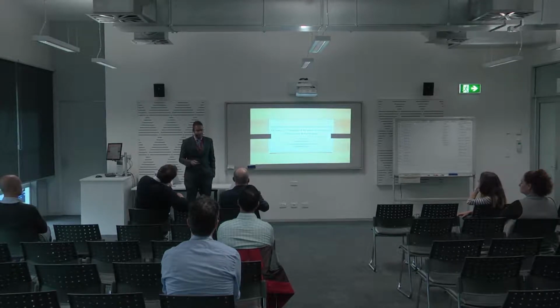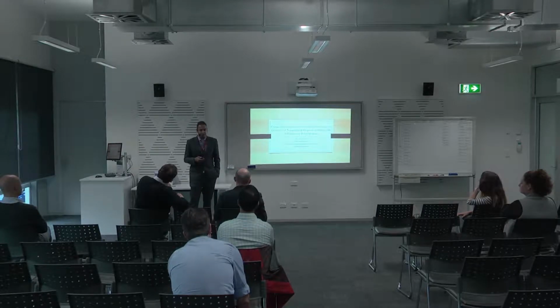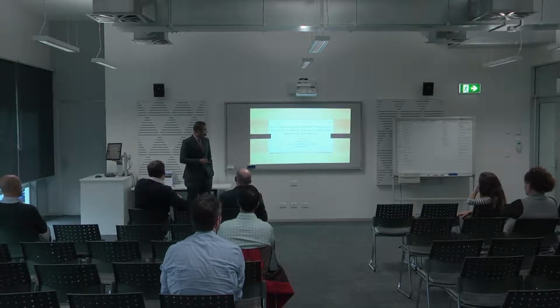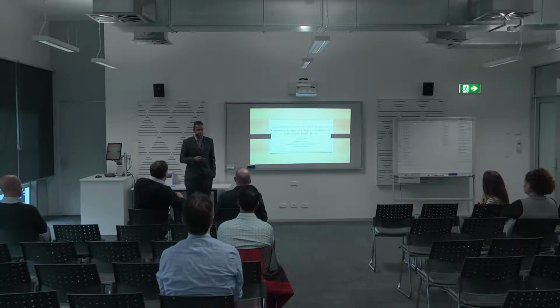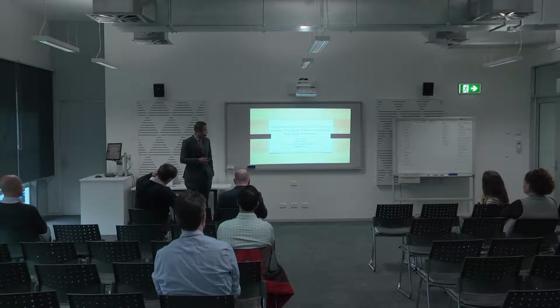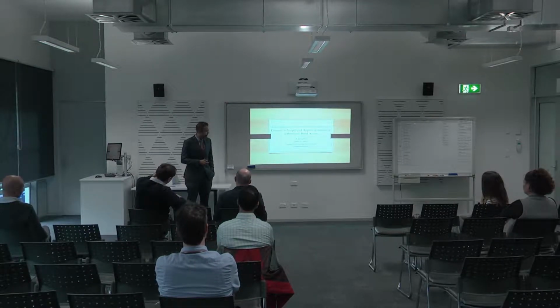Now, I do appreciate that chromoendoscopy is a word which may not be familiar to you, so I'll try and explain that. But essentially, what we did in our study is look at the benefit of chromoendoscopy versus the standard normal colonoscopy in detecting non-polypoid dysplastic lesions in people with inflammatory bowel disease.